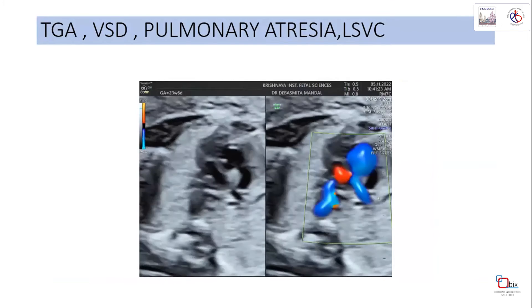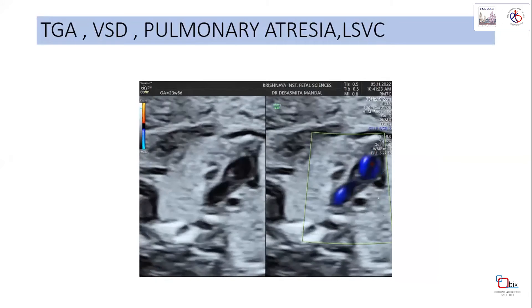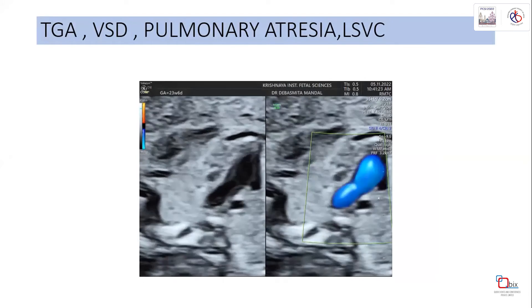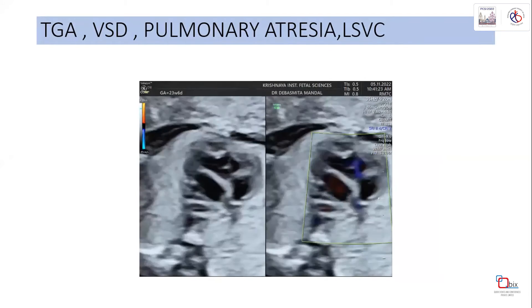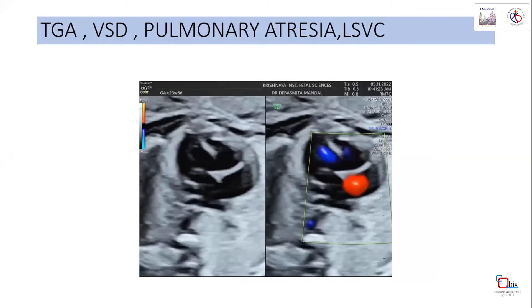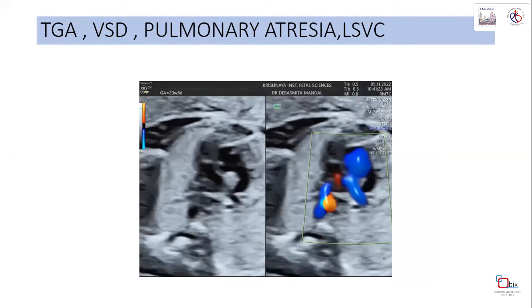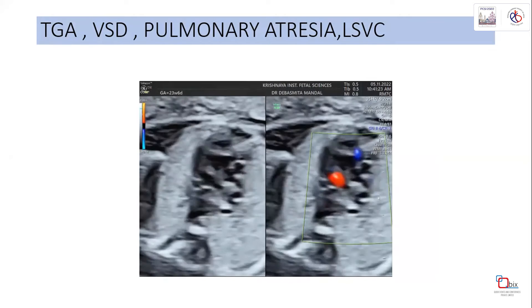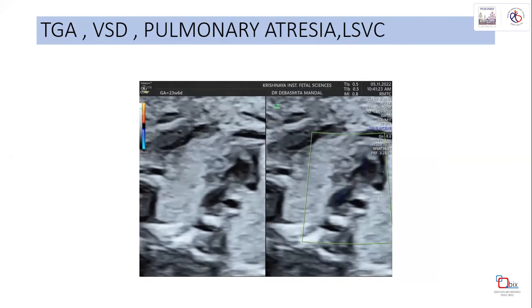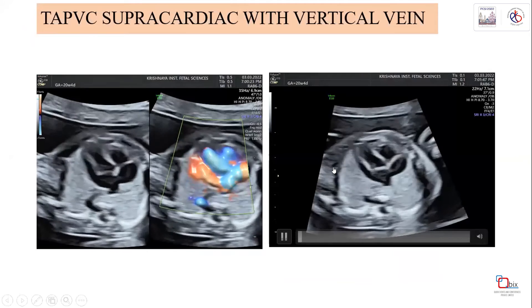This is a case of TGA with VSD, pulmonary atresia, and LSVC. There is a large inlet VSD and only two vessels visible instead of the expected three in the three-vessel view, with LSVC in the corner. Regarding VSD: bidirectional flow occurs because when a VSD is present, right ventricular pressure increases, causing flow in both directions - this bidirectional flow can also be confirmed by placing a Doppler gate.